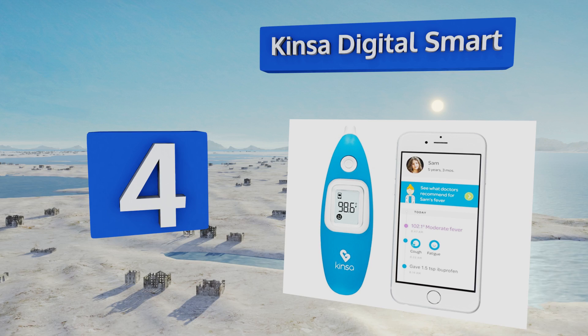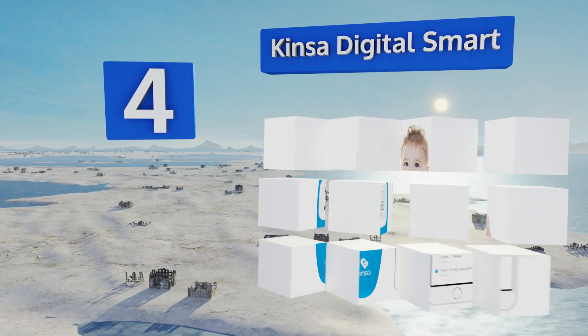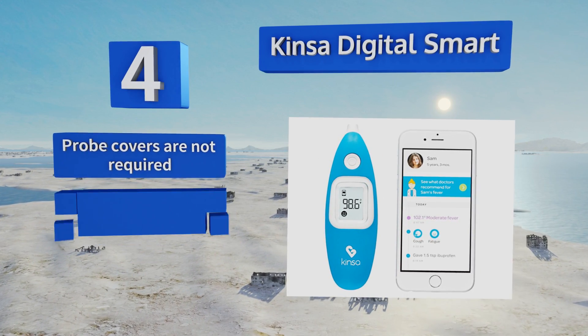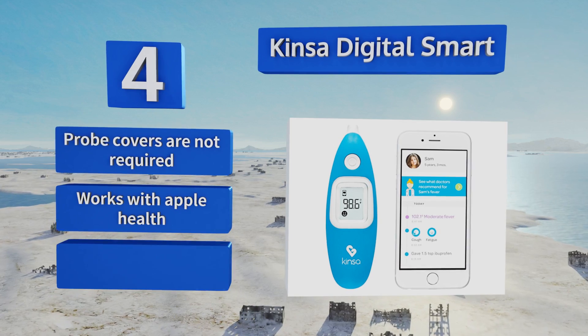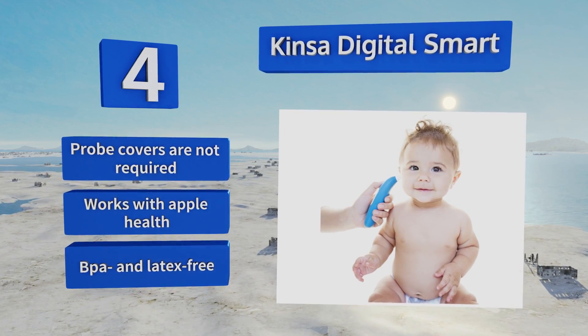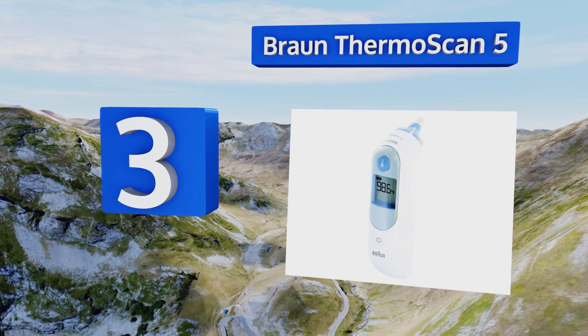At number four, the Kinsa Digital Smart performs its task exceptionally quickly — within one second of pressing the button, you'll know whether or not fever has stricken. The included app offers personalized guidance based on the results. Probe covers are not required and it works with Apple Health. It's BPA and latex free.